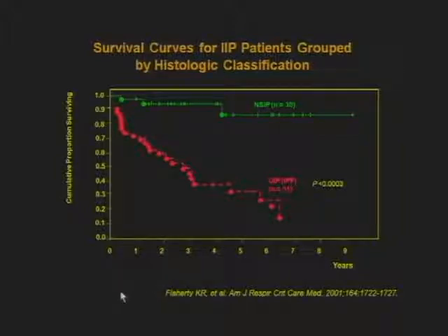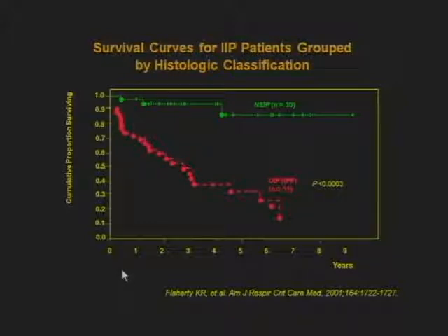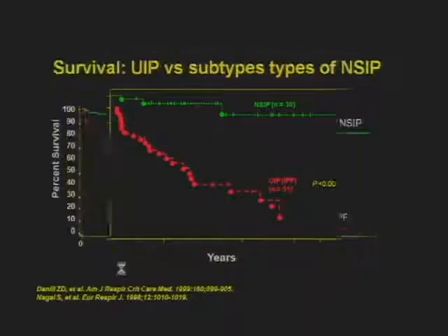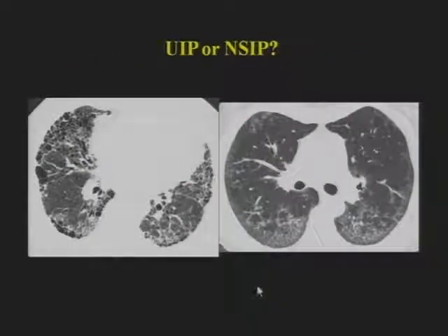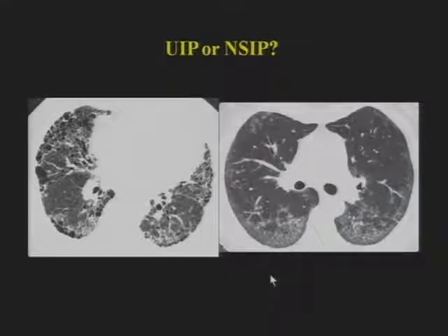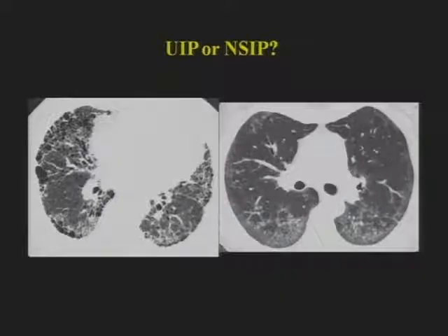Survival curves comparing NSIP to UIP-IPF over nine years show that IPF has a much worse prognosis than NSIP of all types. Distinguishing cellular NSIP from fibrotic NSIP shows that cellular NSIP has a much better prognosis than UIP, with fibrotic NSIP somewhere in between. The two classic comparative appearances: on the left, honeycombing at the lung bases — classic UIP pattern, likely IPF; on the right, ground glass opacity with subpleural sparing — classic NSIP.